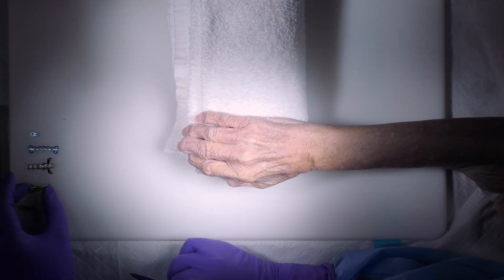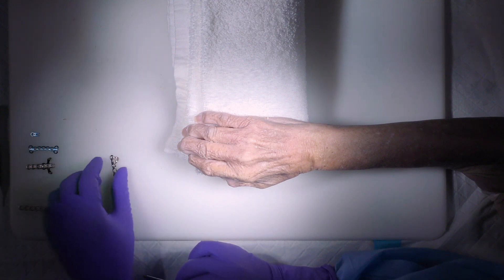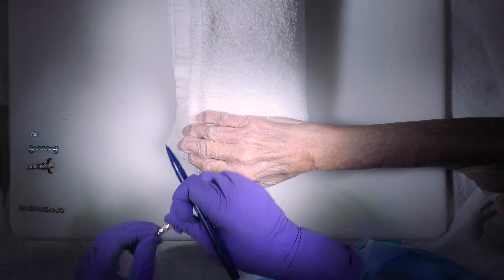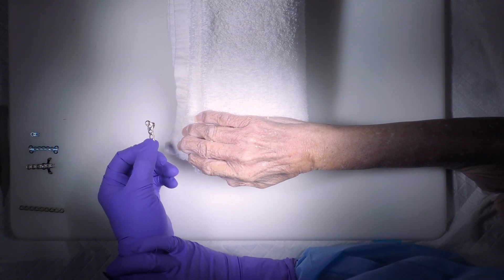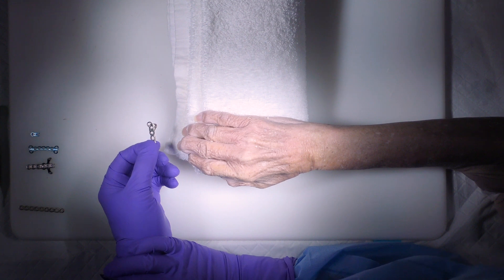We're going to look at the Boxer's fracture plate, which is a periarticular locking plate for Boxer's fractures, which typically represent metacarpal neck fractures.